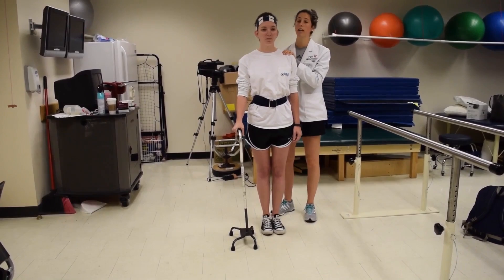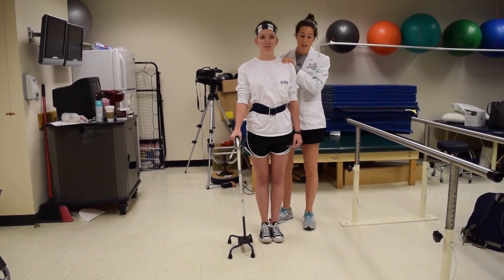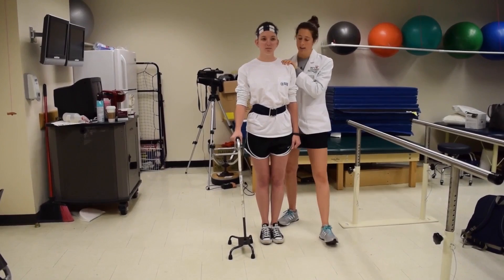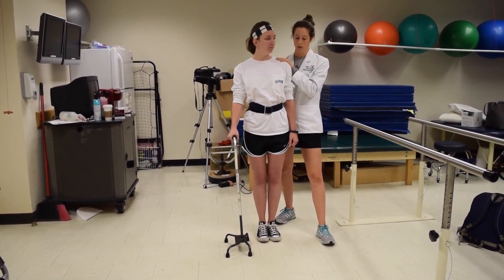When we step forward with the cane — since the cane is being used by her right hand — her left side is our injured side. You want to have the cane opposite the side that is injured. When you step forward, you will step with that bad leg — the left leg — and bring the cane forward with your right hand to meet that left leg.